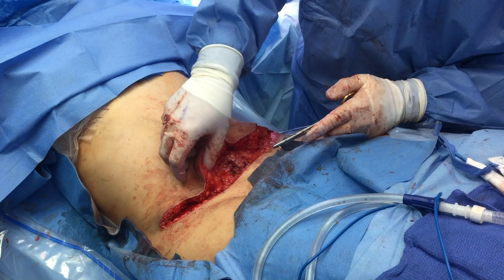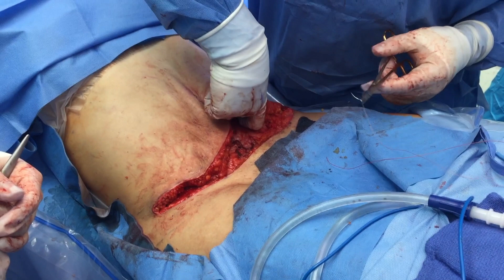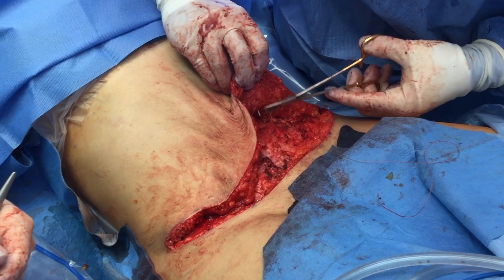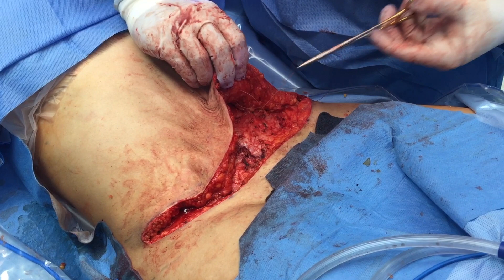Just taking a feel — there's a little gap right here, and I'm going to be able to take that flap and advance it. Taking a nice big bite of Scarpa's fascia back here, recognizing that we can advance it to about this position. I'll take just a touch more — take advantage of the intraoperative tissue expansion, so to speak. And here we are with a nice bite of the anterior rectus sheath.